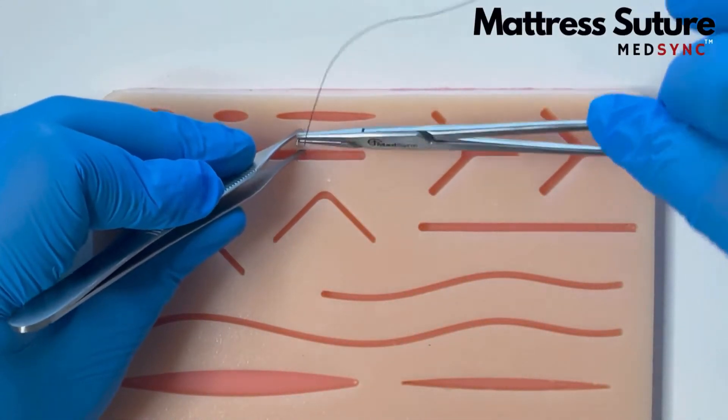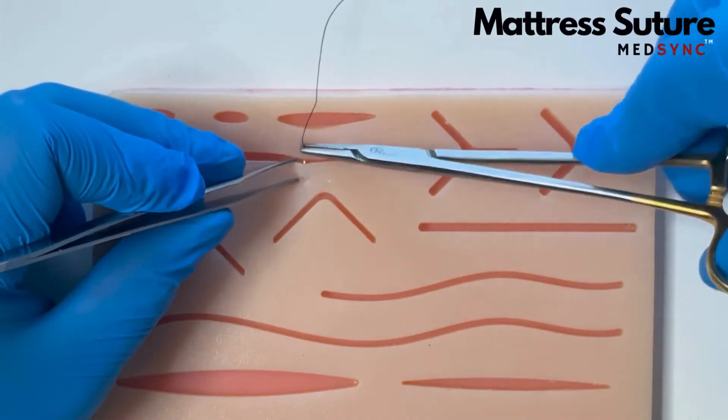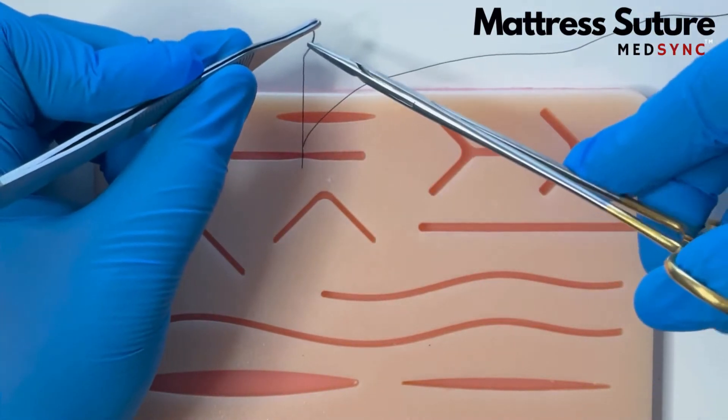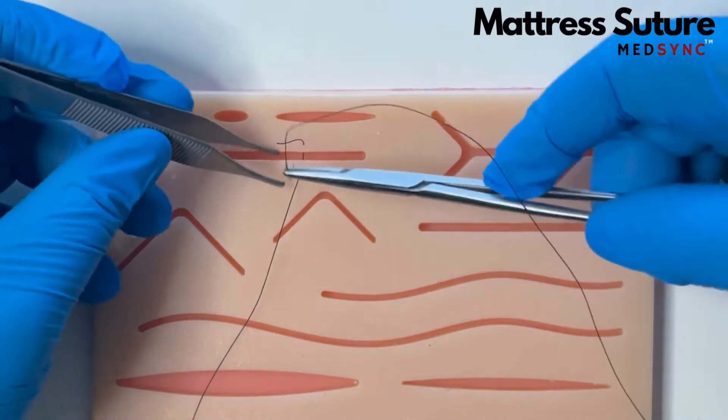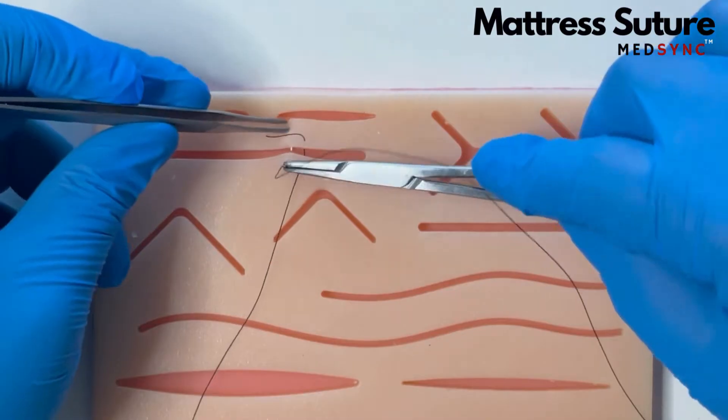The horizontal mattress suture: you take a bite across the wound, you turn the needle around and take a bite back across the wound. You start next to your exit point and you finish next to your starting point.